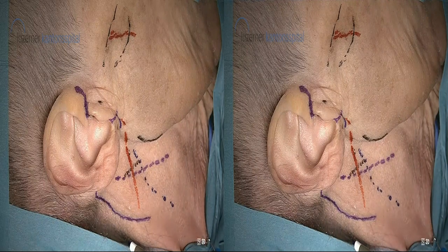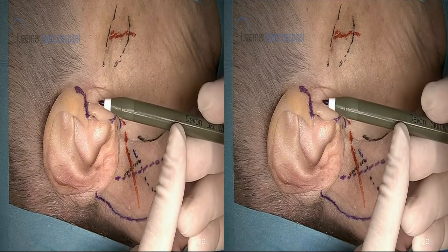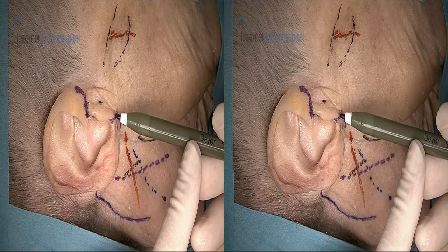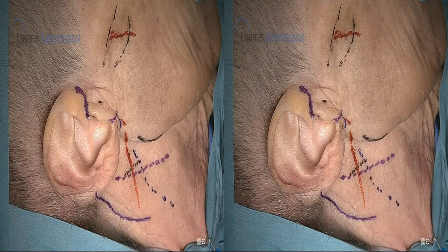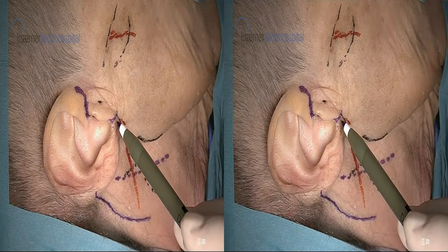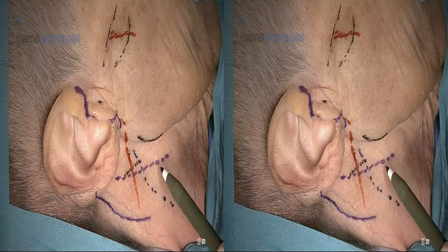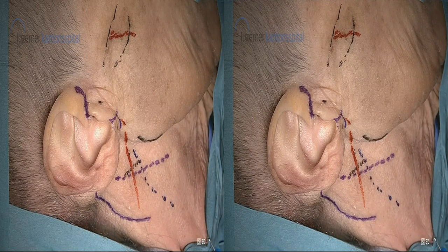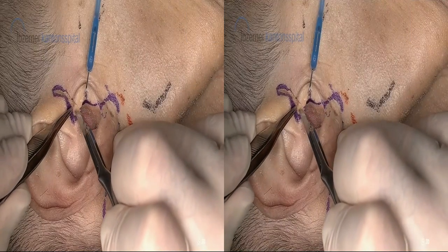Now in an older patient, of course, there are many skin creases here anteriorly. So we may also use, in an elderly patient, the skin crease right here, which will make the scar almost invisible. Now for this dissection, we plan this type of incision behind the tragus and then the standard parotidectomy incision, because I'd like to show you also the position of the greater auricular nerve.